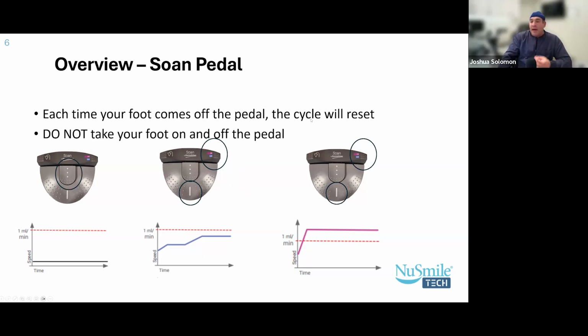And if it doesn't come out, to put a new needle on, you can go back into that exact same hole that you had before.